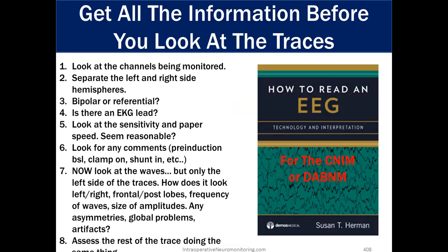So this is my recommendation. If they put a picture of an EEG up on your screen and ask for some assessment of what's going on, like I said in other videos, they're notorious for putting up horrible looking images, poor quality, not what you're used to seeing, different montages, the whole nine yards.